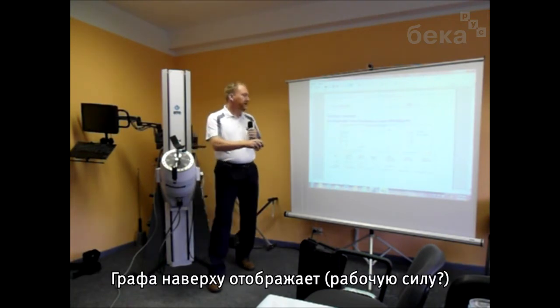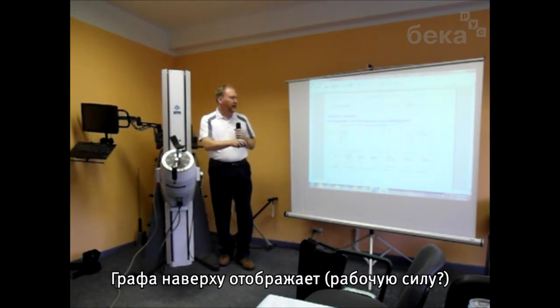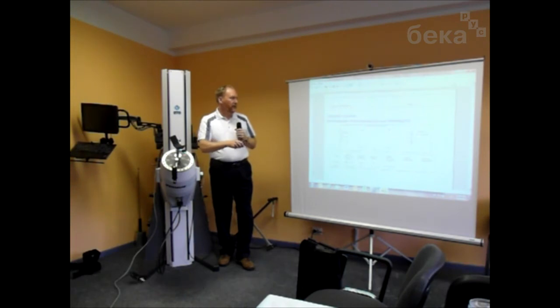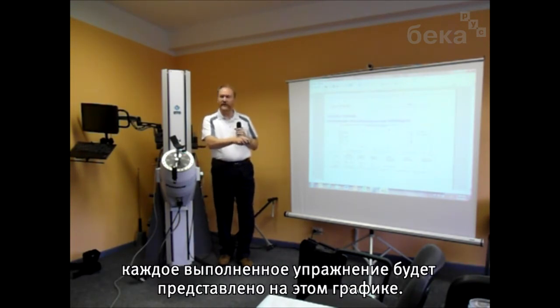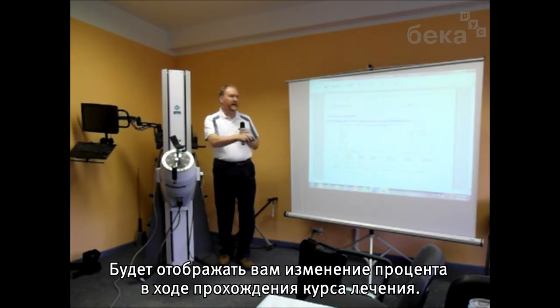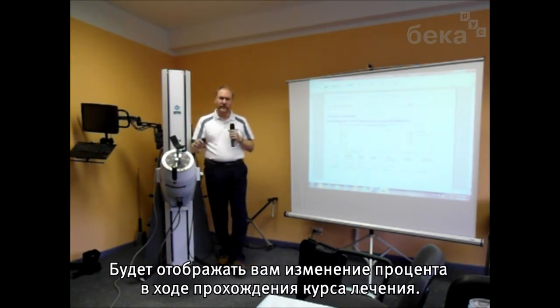And then the graph on the top shows you work and power. For the first session, second, third, fourth, every session will be represented on this graph, showing you their percent change over the course of the entire treatment sessions.